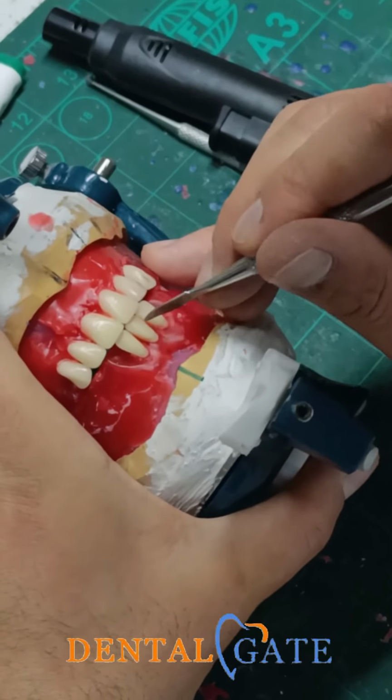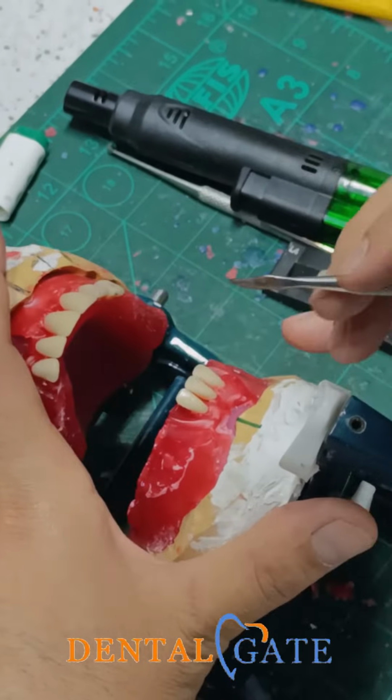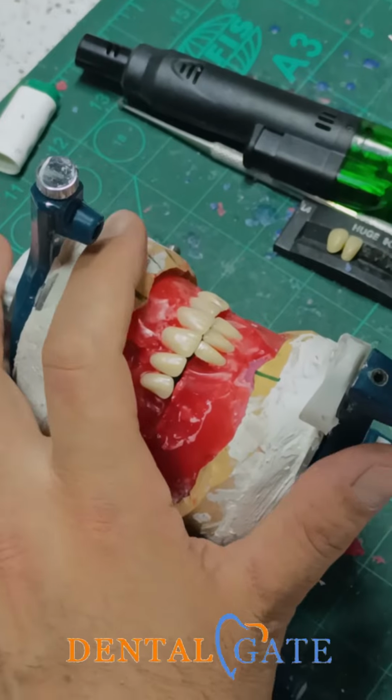Okay, we had a contact here, we had a pressure area here. Don't need to make any inclination. Okay. Now I will start with the canine.